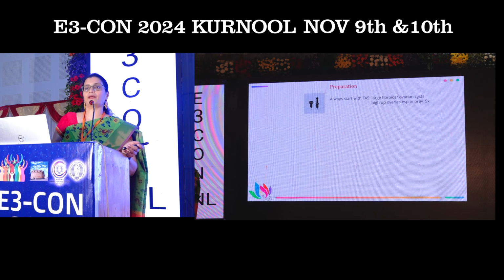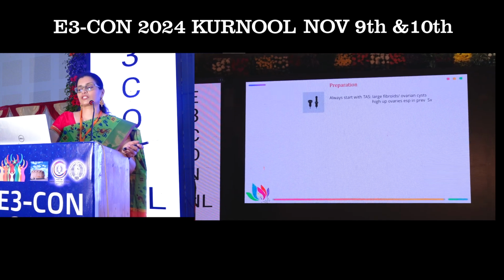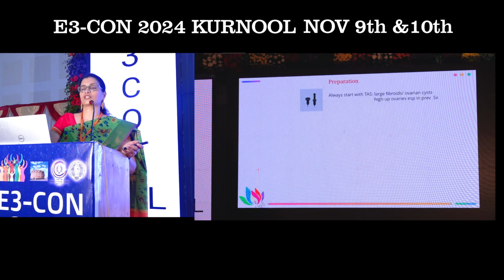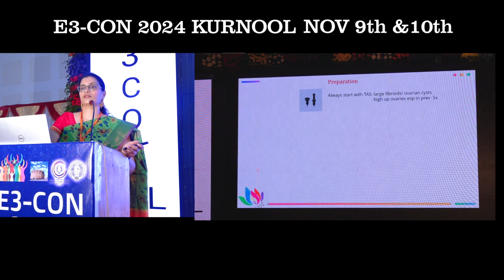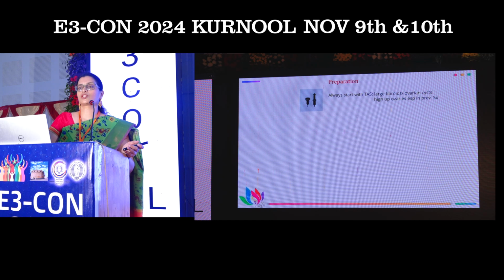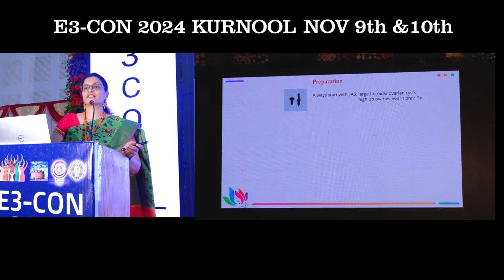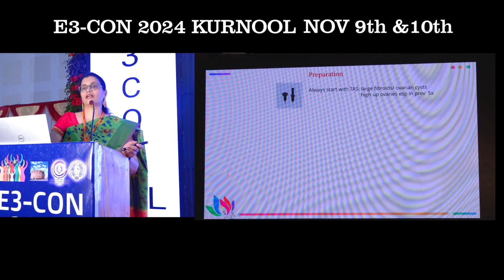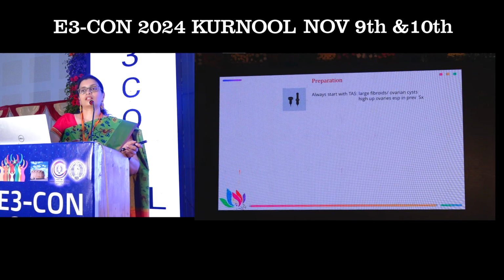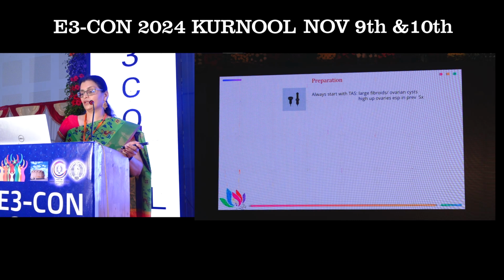So how do we prepare the patient for the scan? It is always best to start with a transabdominal examination because we have seen that the transabdominal scan gives us a wide angle, bird's eye view of the pelvic organs. Sometimes there may be a large cyst or a large fibroid which might be missed if you directly do a transvaginal scan. And also always screen the kidneys and the bladder at least before doing the transvaginal or even going and looking at the uterus and the adnexa.